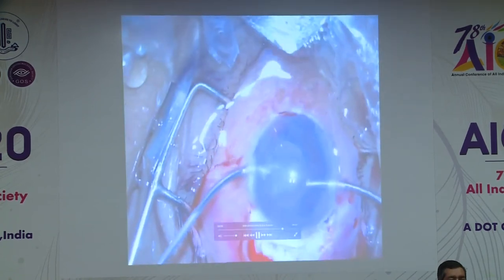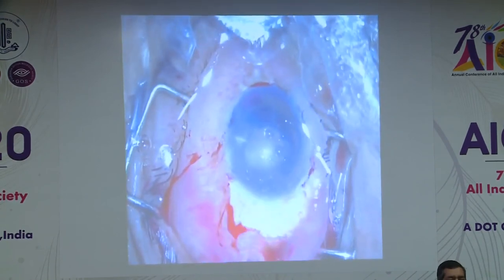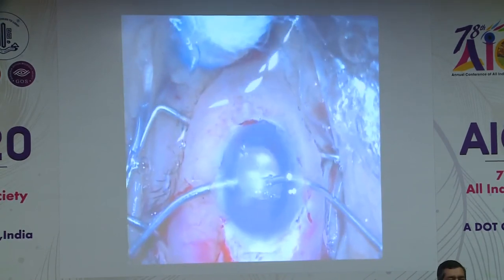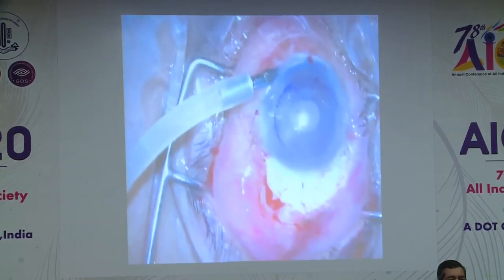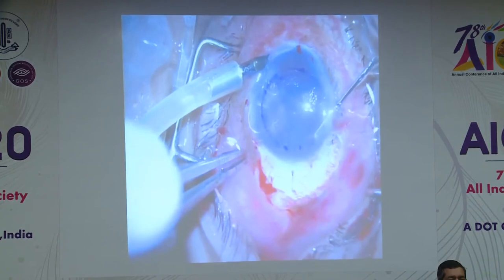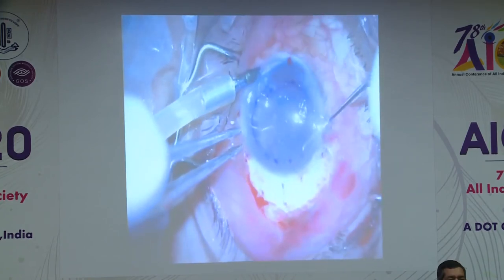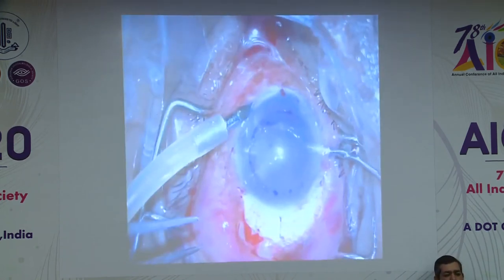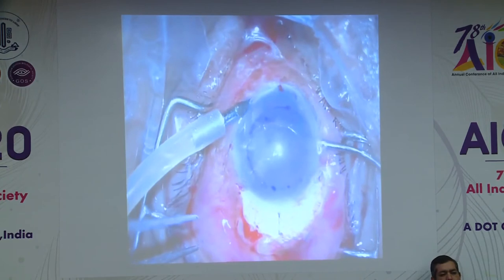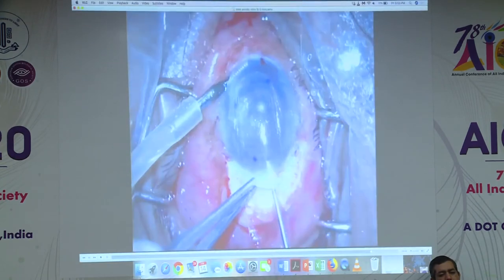Then I went ahead and did a conventional phaco, put the IOL, and this is when I'm inserting the IOL. And then after that, went ahead and did the DSEK conventionally in the proper manner. So these three cases, I just want to show that they were different scenarios. And with judicious use, you can go ahead and manage these tough cases also. I'll show you the post-op of these cases.